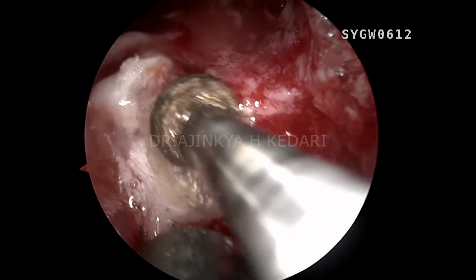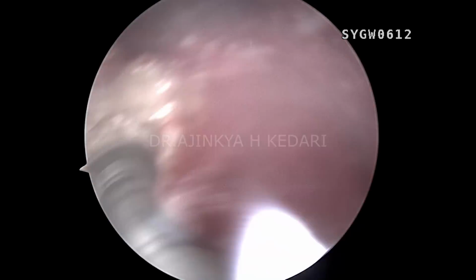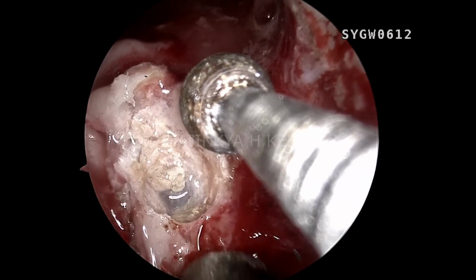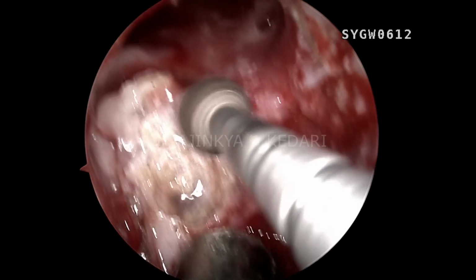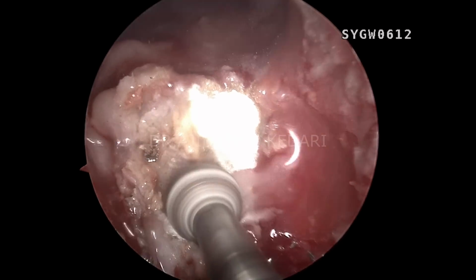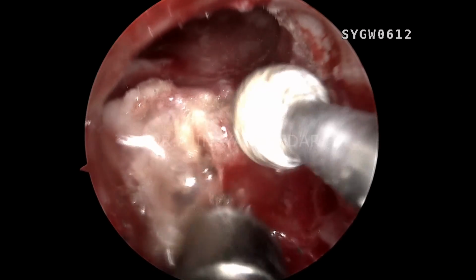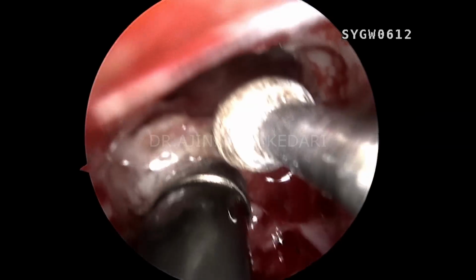The reason I'm drilling this area is because the actual defect, which is a huge defect you could see sometime back, is lying behind the angular edge of this bony projection. So I need to drill this and make it flat and uncover the actual defect which is behind. It could be a bigger defect than what we can see right now. So we need to drill this and uncover the original defect from below.